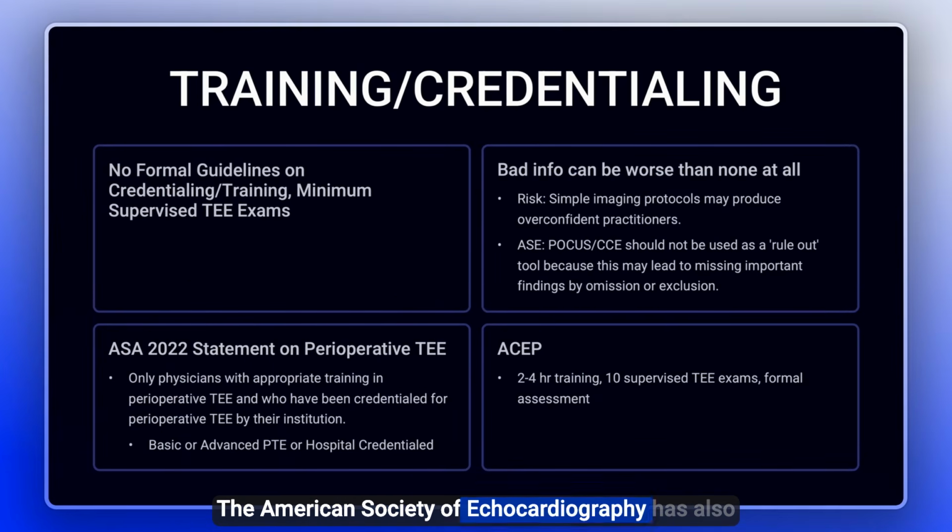The American Society of Echocardiography has also made a statement on point-of-care ultrasound or critical care echocardiography that it should not be used as a rule-out tool because this can lead to missing important findings by either omission or exclusion. It can rule in diagnoses but shouldn't be used to definitively rule them out.